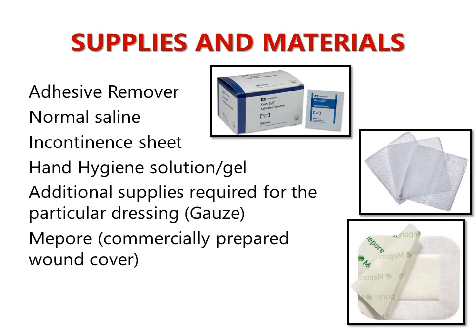Aside from that, there are additional supplies and materials that you need to prepare. You have adhesive remover. Adhesive remover is important because you will be using this in order to remove an old bandage. Remember, if the bandage is stuck on the patient's skin, it is very difficult to remove and it might cause some pain to your patient. To avoid pain, you apply adhesive remover. In the video later on, you're going to see how the nurse is using adhesive remover.